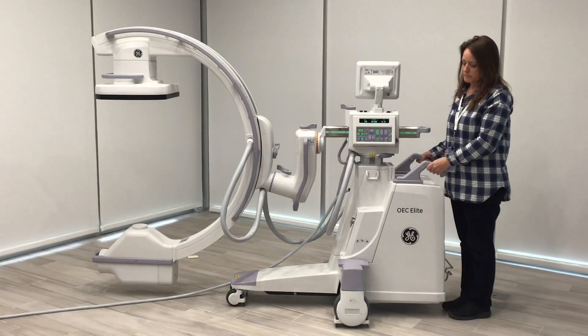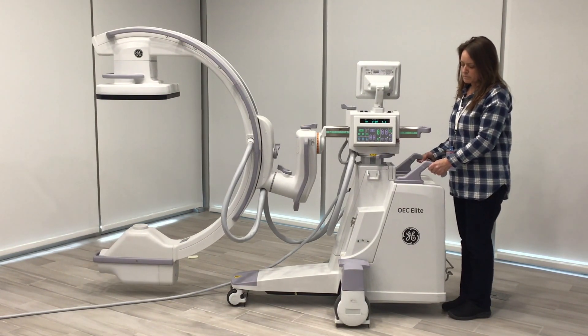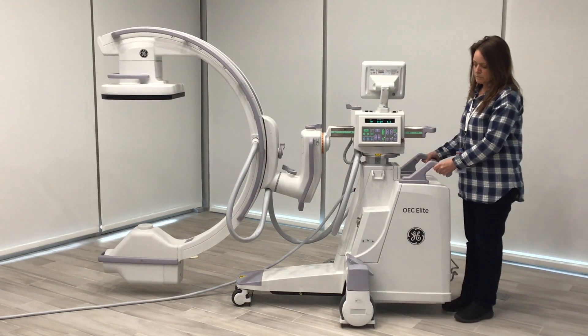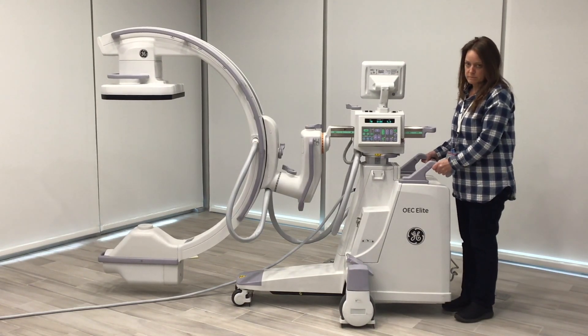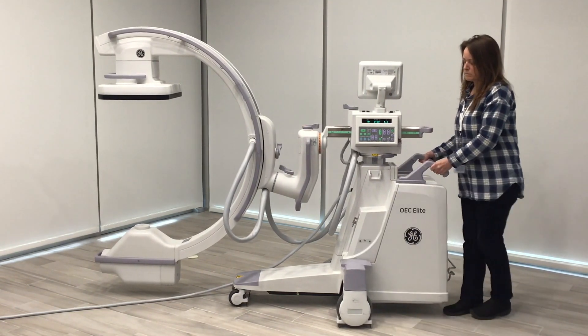So we're going to go over the locks and brakes on the GE Elite C-Arm. The first one is the floor lock — the actual brake lock of the C-Arm. You depress the pedal down and it allows no motion forward or backward of the system. When you unlock it, it allows complete motion forward and backward.